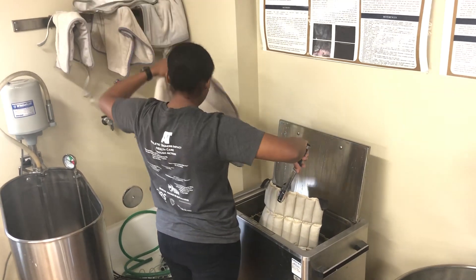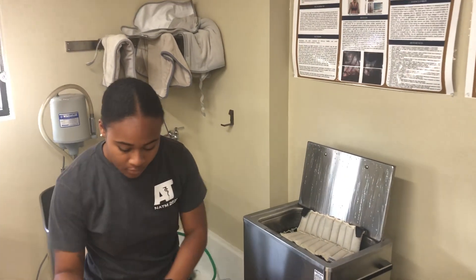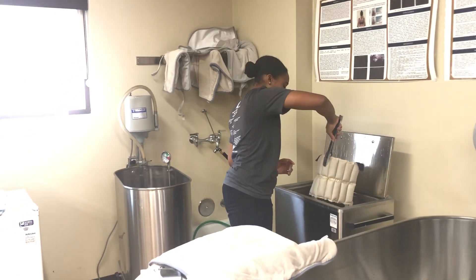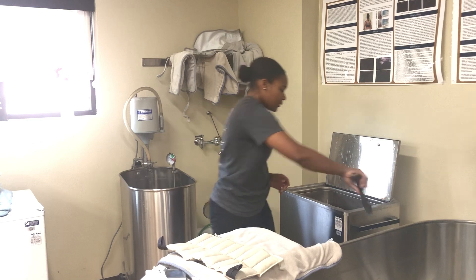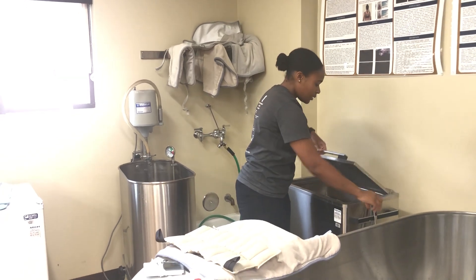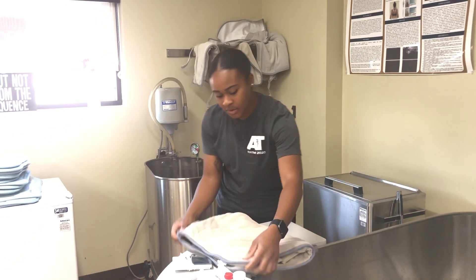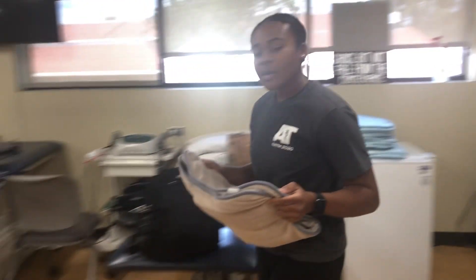Then we're going to use a wrapping. We come here, place the wrappers on the pad, make sure that it is nice and secured in, and then we walk back over to our patient.